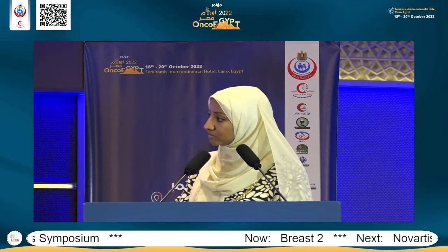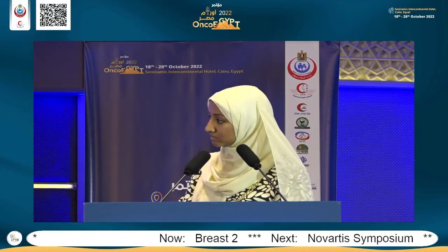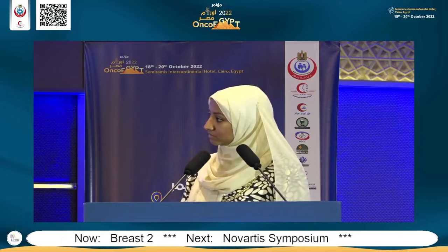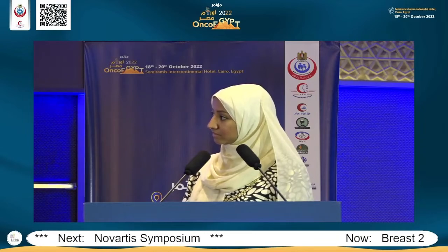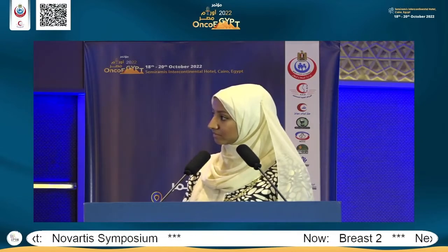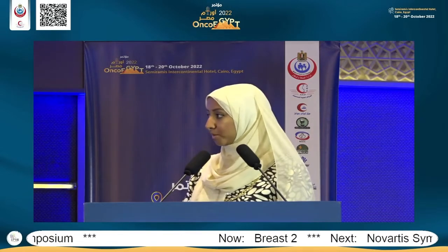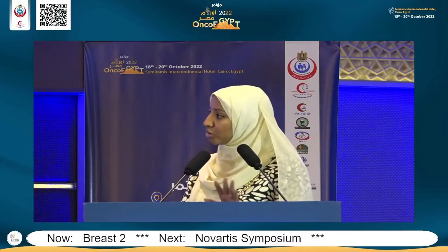خلاص اوبسوليت الماموجرافي فور ايرلي ديتكشن اوف بريست كانسر، علشان هم عارفين ان الفيميل تشاينيز هاف ا فيري دنس بريست تيشو، سو زي ار ريكومند بريست التراساوند. هقدر اقول دلوقتي with contrast لا ارجع للماموجرافي تاني، ولا برضه هيبقى عندي ميزد ليجن؟ لأ، إحنا طبعًا بنستخدم السونار برضه، بنرجع له في حاجات، بس الفكرة إن إحنا بنعمل ال2D الأول، بنبدأ بال2D العادية، الimages الماموجرافي العادية جدًا.